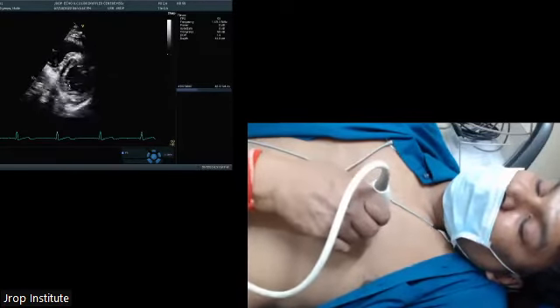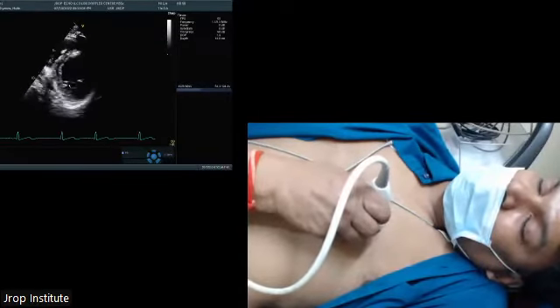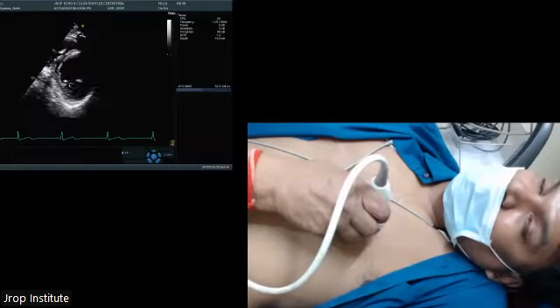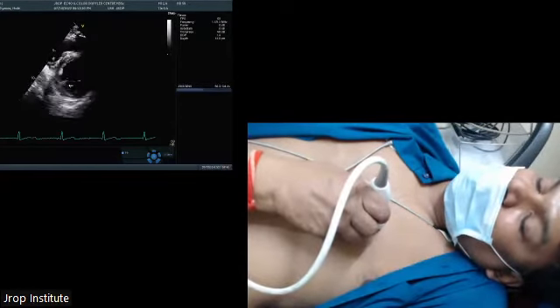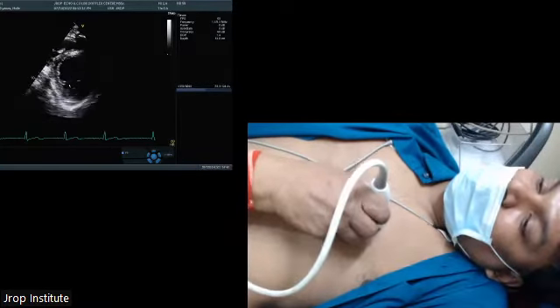I could not see the screen. That is your problem, man. Click and come back again. Everybody is able to see it. Correct? Please come on screen. Sir, index marker at which position, sir, now?